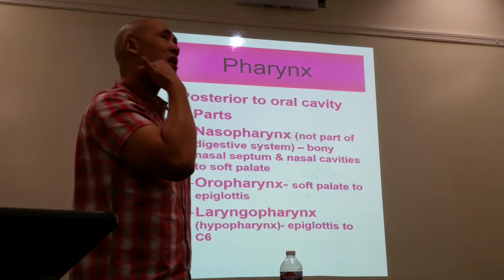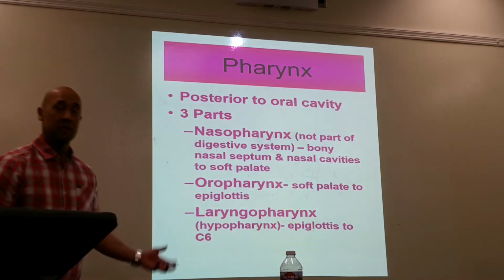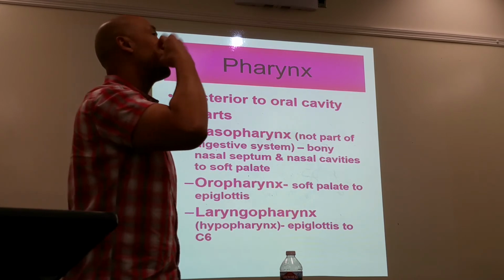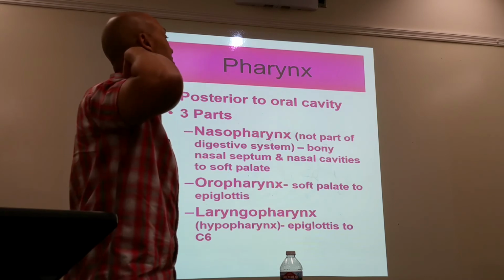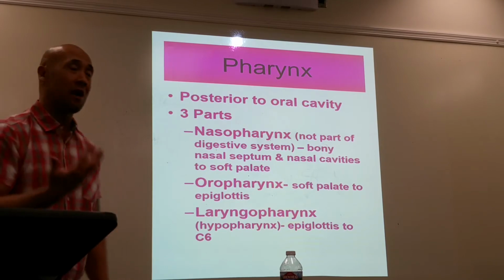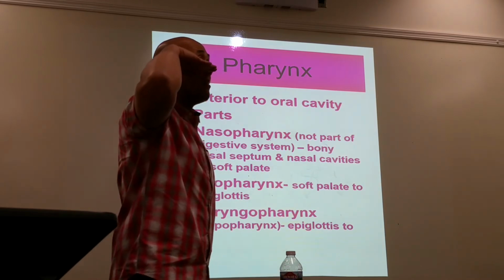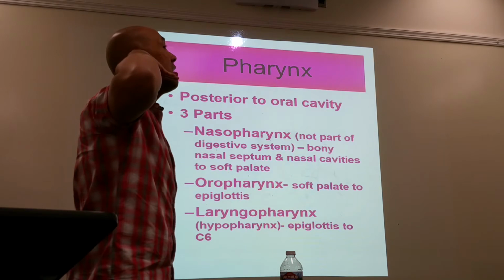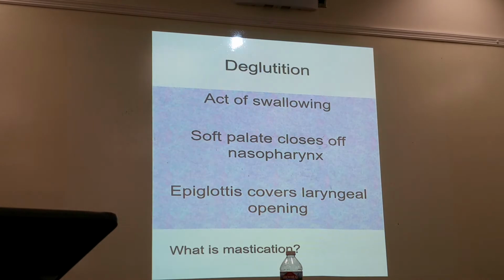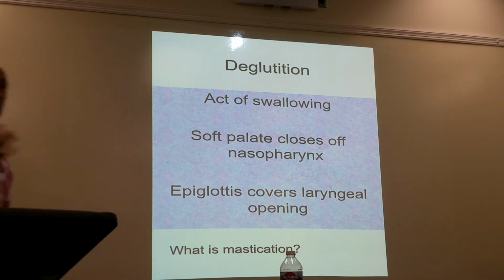So, kind of where the angle of your jaw is, Adam's apple level, is where the esophagus starts. So when we do an esophagram, we are looking at your esophagus from here to here. I don't want to look at your mouth. I want to look at the esophagus from here to here, starting at the level of C6. So when positioning your image receptor for an esophagram, you see a lot of technologists having the top of their image receptor up to here. That's wrong. It should be down here somewhere. Now, are you going to correct them? No. No? Okay, good. Because this up here is not part of my digestive system. Unless you can swallow with your nose.